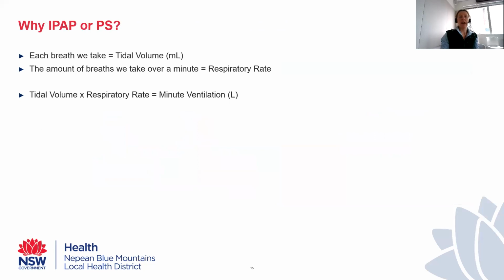All right, and I alluded to this a couple of minutes ago, but why do we want to add in either an inspiratory pressure or pressure support? Why do we want to add in that extra level of support when a patient breathes in? It's because it helps them take a bigger breath. Now, bear with me. If you've not done ventilation before, this might be starting to get a little bit of brain overload, but it is important that we understand this.